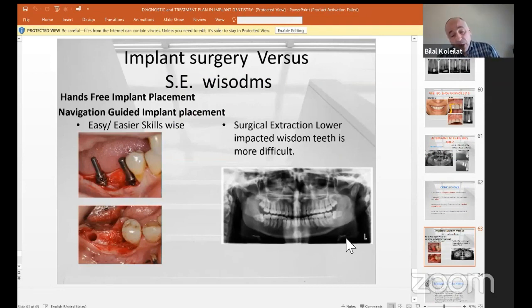You know, when we work in a hospital setting or a specialty center and we have a junior colleague to train, and as the implant is booming all over the place, I always tell them, you know, the implant drilling steps are very easy to be done. Even if it is a hands-free implant placement, and even for me as a specialist surgeon doing this work daily, especially now with the newly navigated guided implant, I don't feel that my skills are useful.